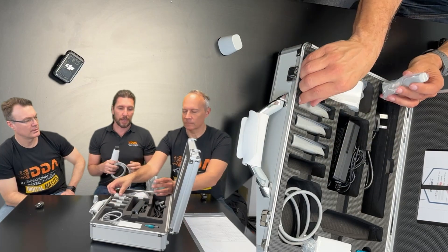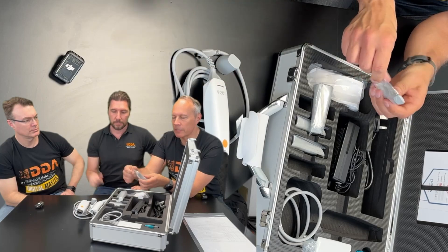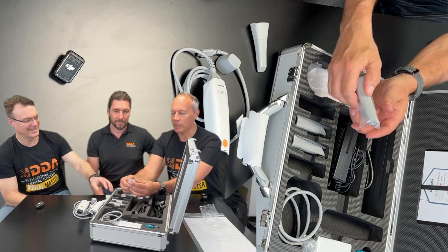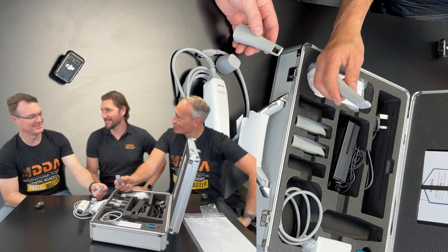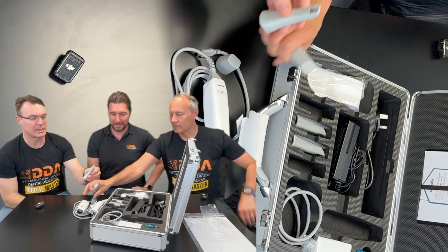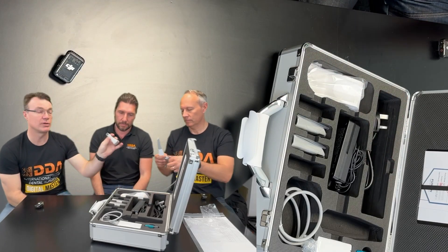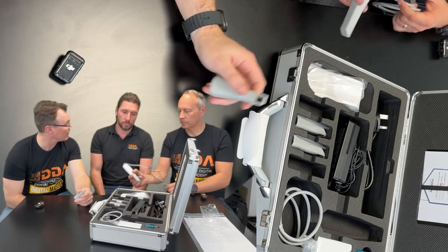With the software installed, we have different size tips. There's a nice variety here, from the really tiny one that we can use for those posterior molars that can be really difficult to reach, or if you're scanning a child — that's really nice and small, almost the size of an Omnicam. It comes with four tips, basically a progression of sizes from smaller to bigger, and it clips on nicely. One thing to note is that the tips have an electronic connection to the scanner that heats up the mirror so you have less fogging, which is a great feature.